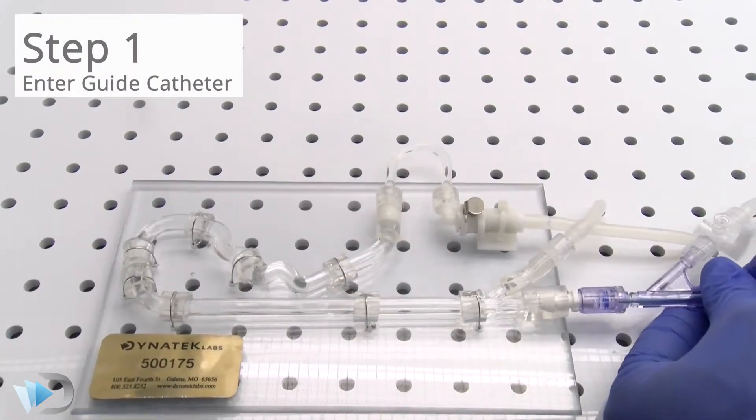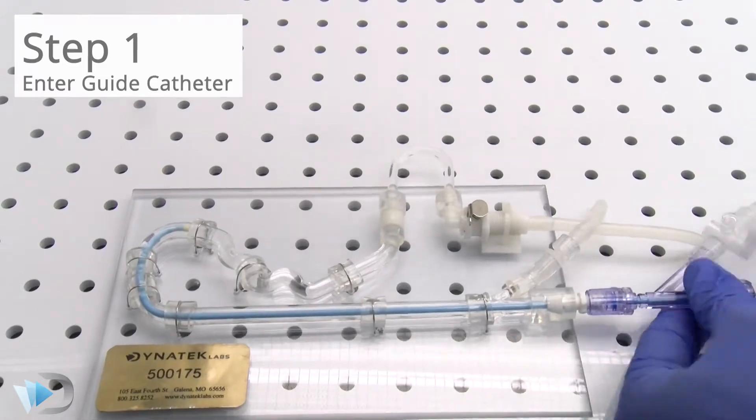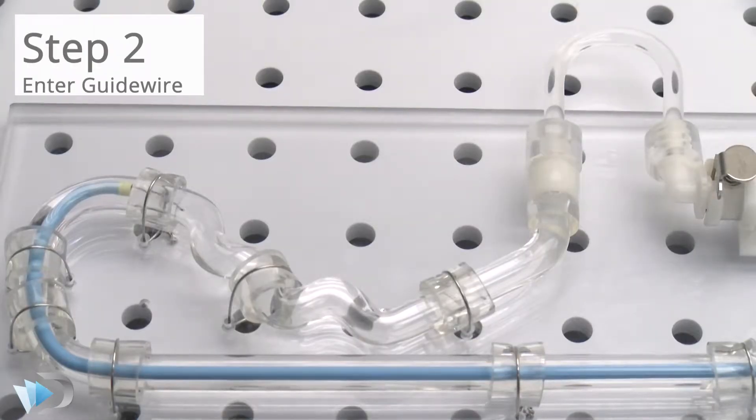To begin the test, a guide catheter is inserted into the flow loop. Then, a guide wire is advanced through the catheter and into the deployment site.